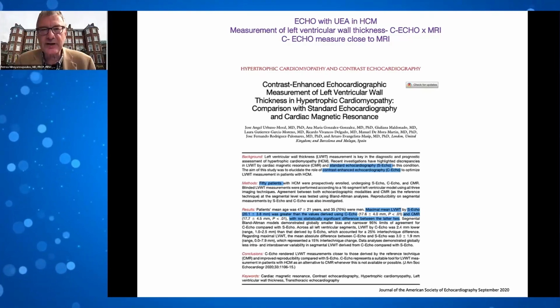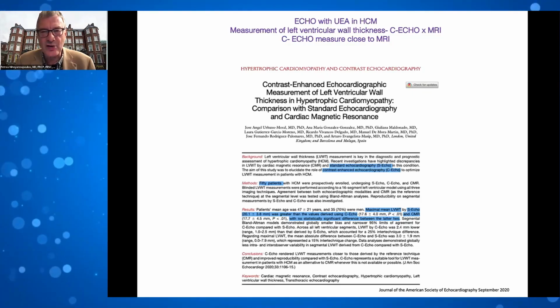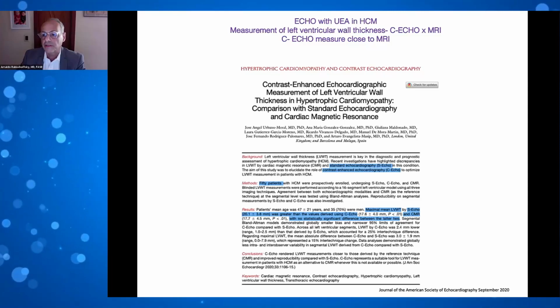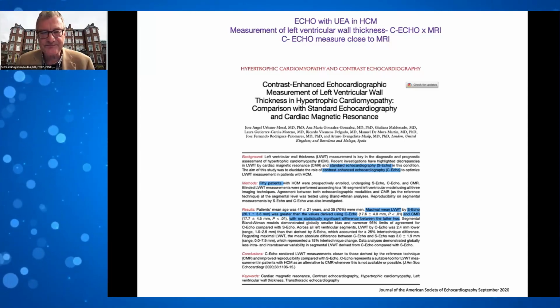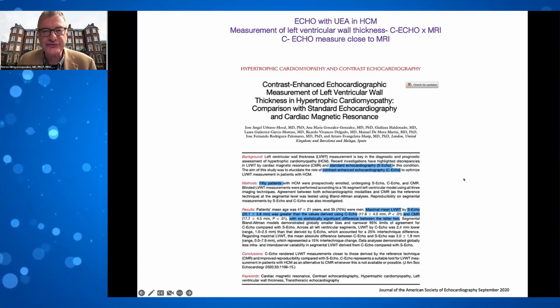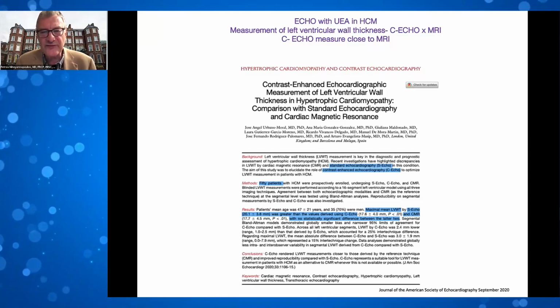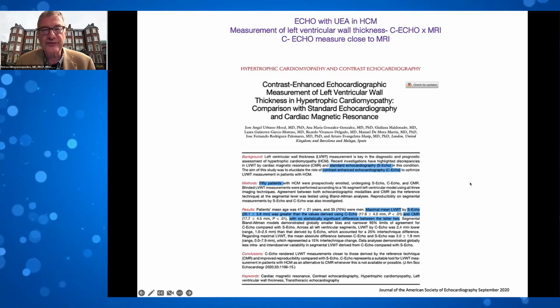Thank you, Pat. Can you give us approximately what percentage of echoes during your daily practice you use contrast echo? I think about 20%. 20%. That is quite an impressive number. And final question from me, whilst there are no questions from the audience, who is doing the injections? Is it the doctor, or do you have qualified nurses or echocardiographers, sonographers who do the injections?